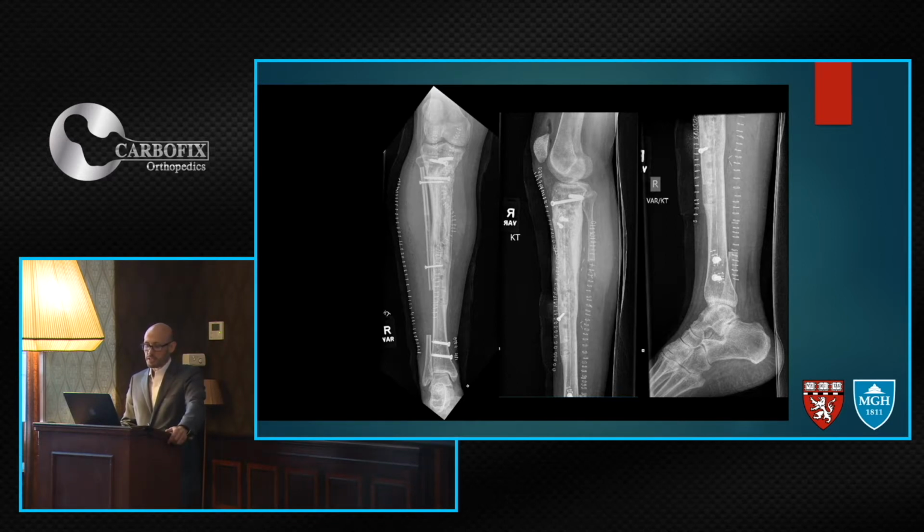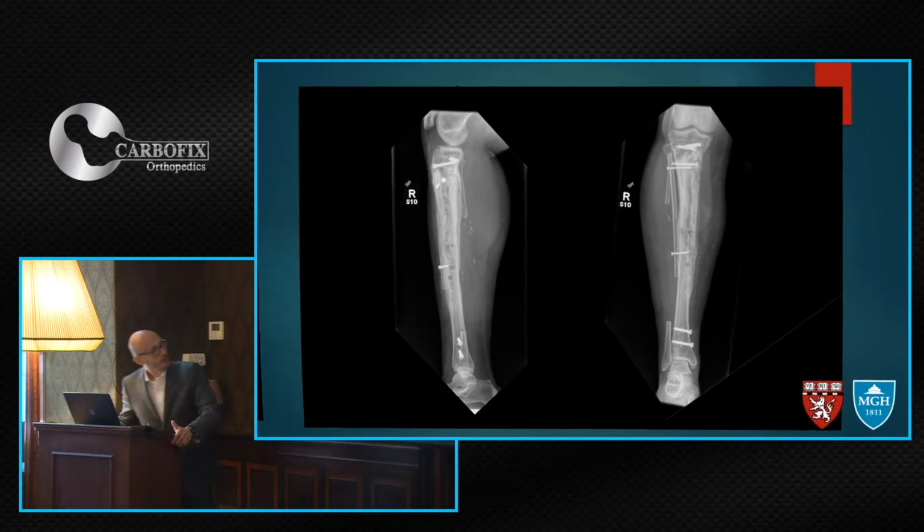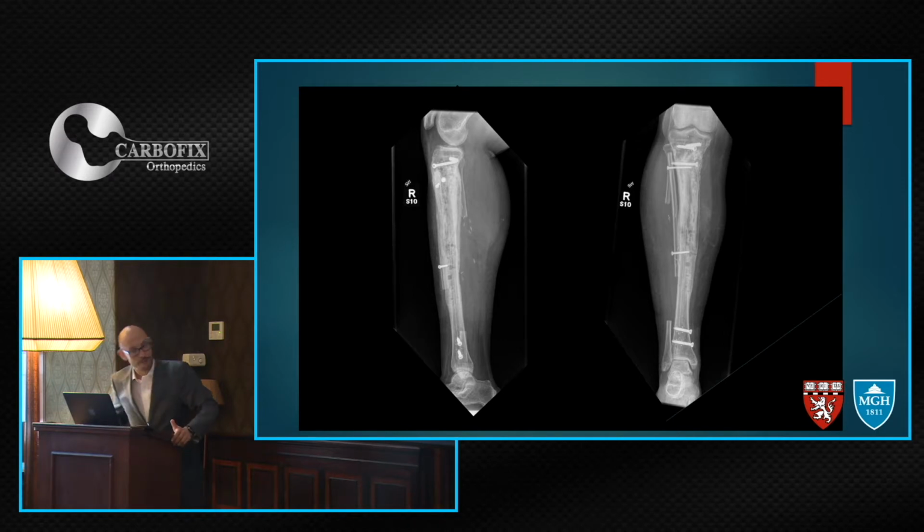I was worried about the allograft. This patient is not very compliant. So I decided to transport her fibula to bridge the proximal, her own bone, with the distal part, and kind of to increase the area of biologic reconstruction. And she sustained a fall, and she had a unicortical fracture of the allograft, but it has not progressed, and I think it didn't break because of the nail, which I think probably with a plate it would have failed.